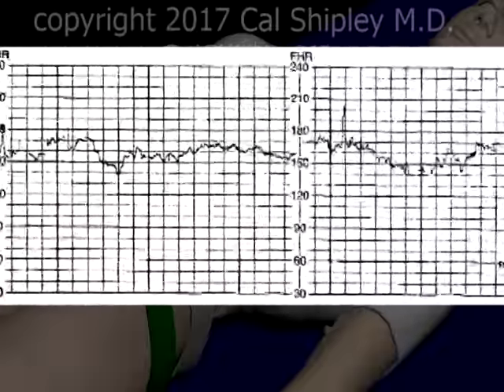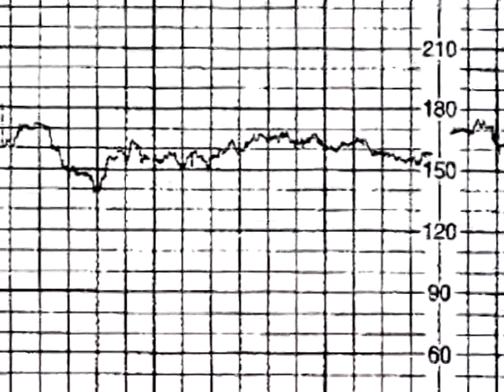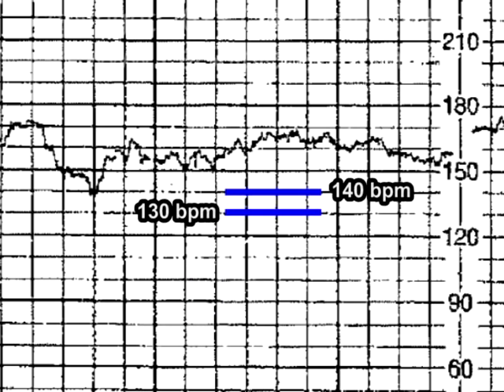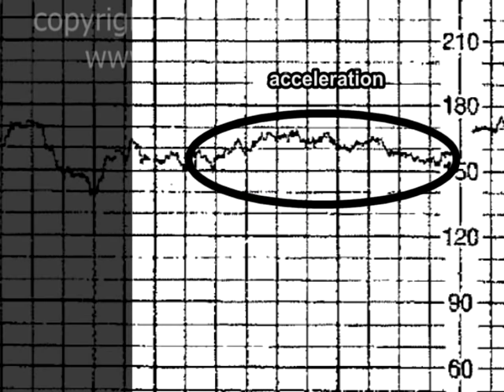Now let's take a closer look at one of these accelerations. The distance between each of the vertical lines on the FHR strip represents a 10-second interval, while the space between horizontal lines represents a difference of 10 beats per minute in the fetal heart rate. So with that knowledge in hand, let's take a look at this particular acceleration and see if it meets our criteria for a reactive NST.